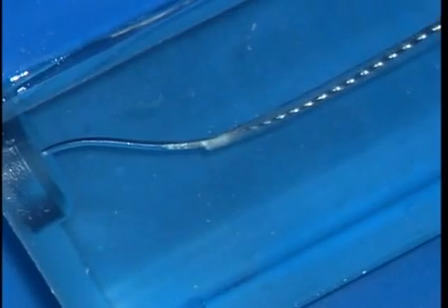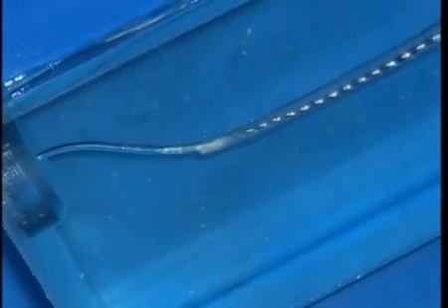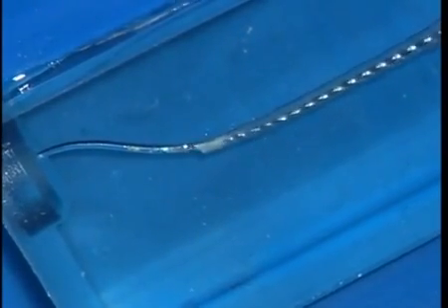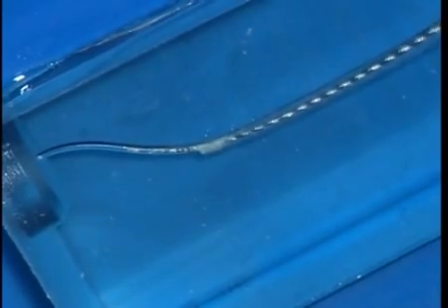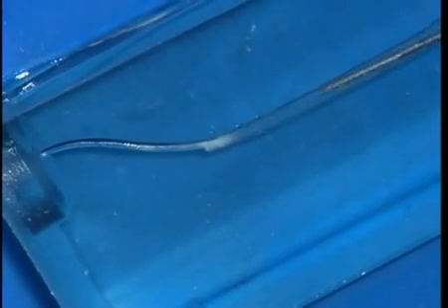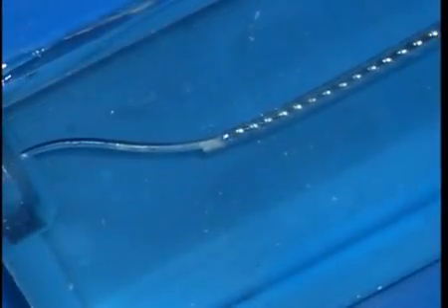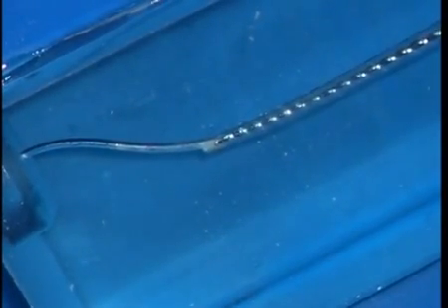Notice as we come up against the obstruction, the file will not move apical. Little short amplitude vertical strokes begin to engage the end of the file, and you can see it beginning to move just apical to the debris and bypassing the ledge. Little short amplitude strokes move debris into solution, so that when we re-irrigate, we can flush out some of this debris. Again, the pre-curved file is brought into the root.